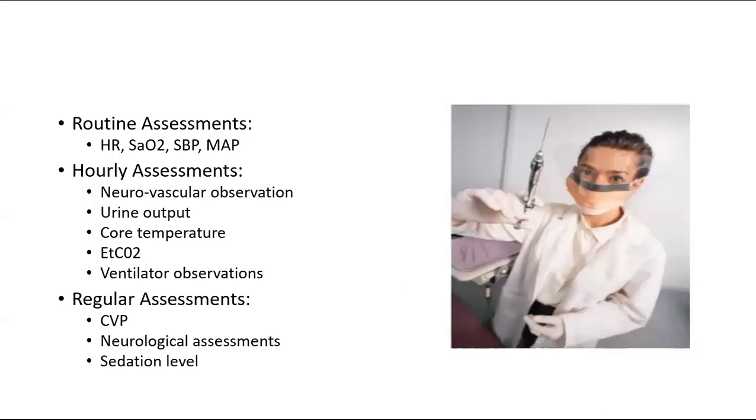So your ward boys and attendants who come for patient positioning might not know the importance of these cannulas. They simply turn the patients on their own, or because of lack of knowledge, they think the patient is like any other routine ICU patient. But the bedside nurse should take care of all these responsibilities and make sure the cannulas are not coming out or going in while doing any positioning. This is the basics of ECMO management when it comes to the nursing side.